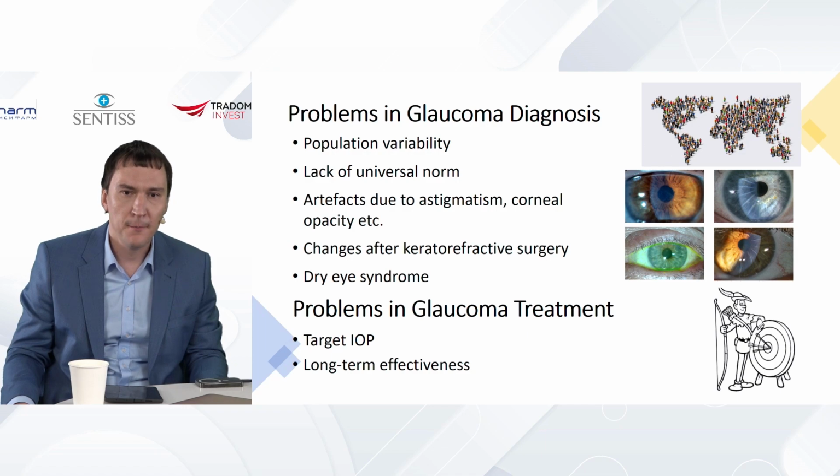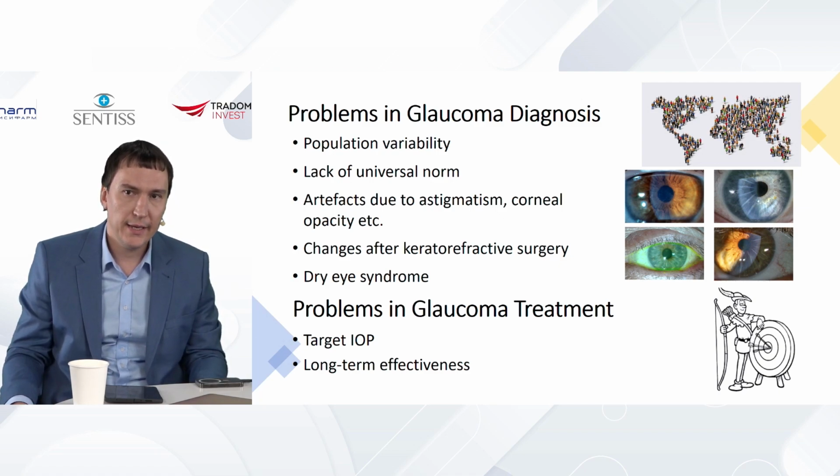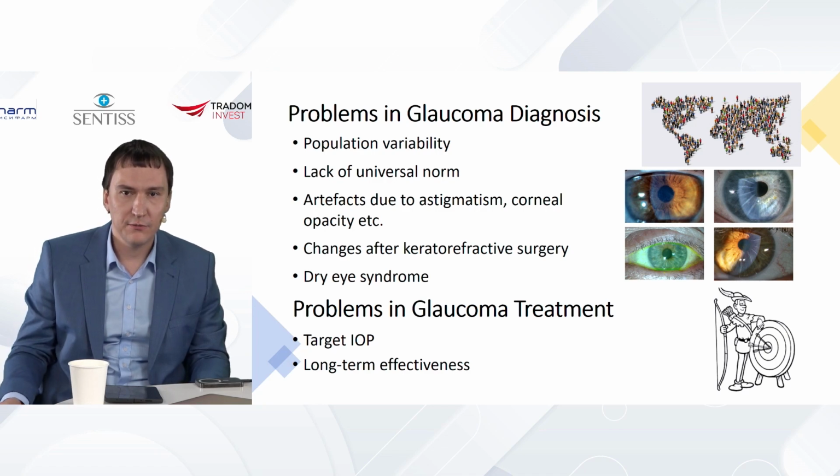Here we have even more challenges because all the characteristics that we talked about today are mainly focused on the analysis of the current situation. And if we speak about the analysis of images, then looking at the image, only the image, it is very difficult to make the prognosis, because the basis for the prognosis is either the series of images that we obtained with some intervals, or it could be intraocular pressure. That in a glaucoma patient is very important.